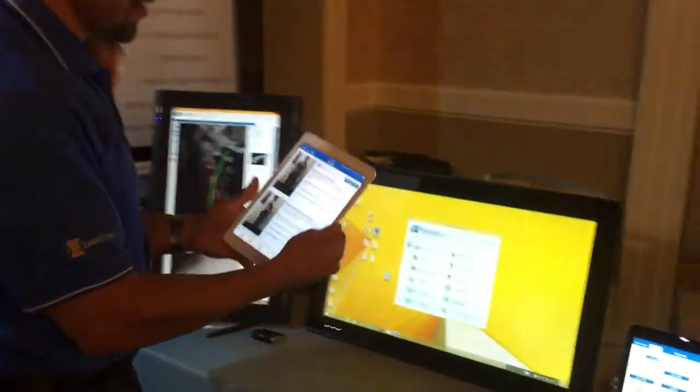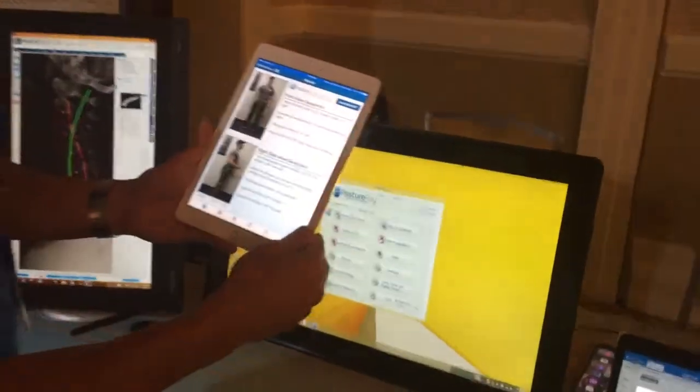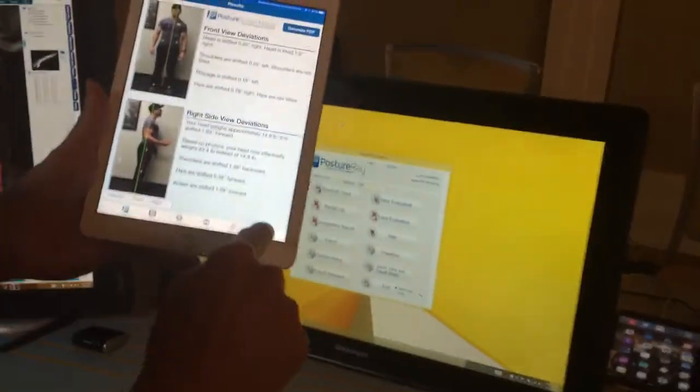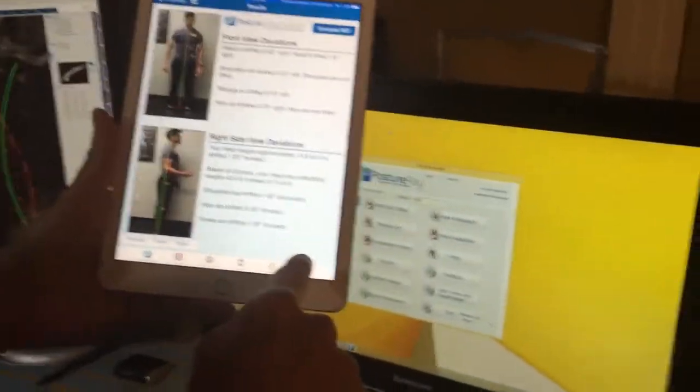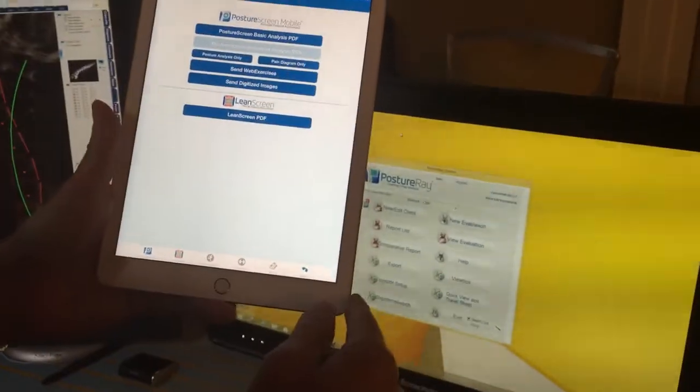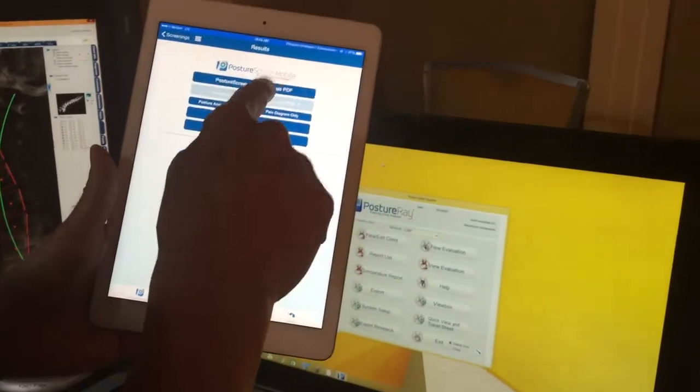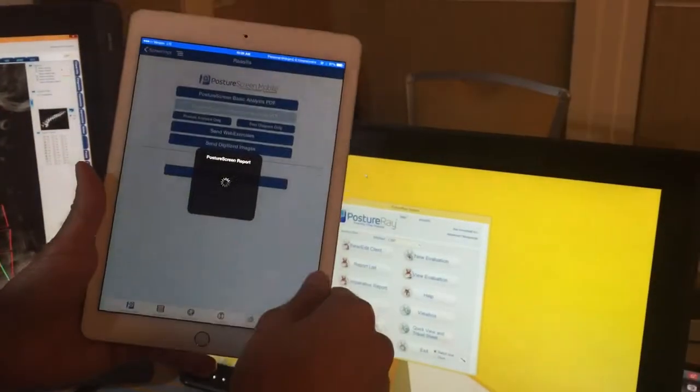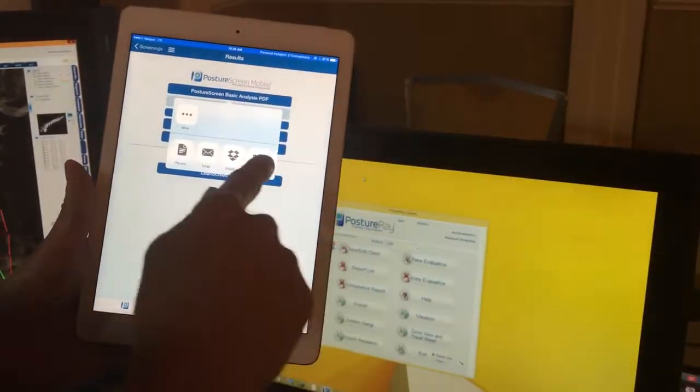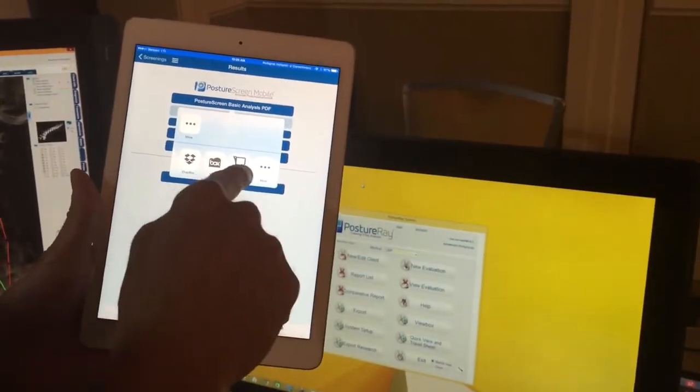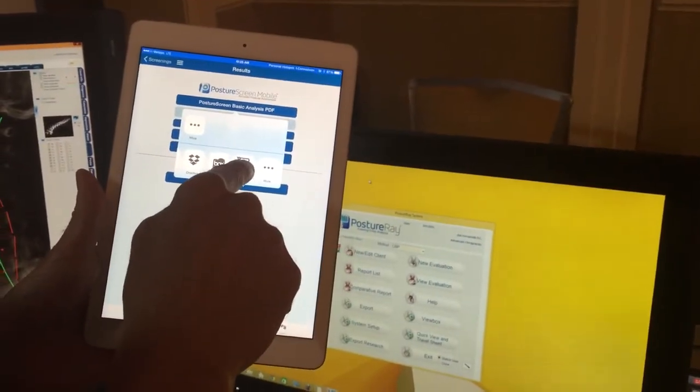So come on in, let's take a look. What we're gonna do is I'm gonna go ahead and push this. Once it's set up, we're gonna go in and hit Posture Screen and you're gonna scroll to Posture A.